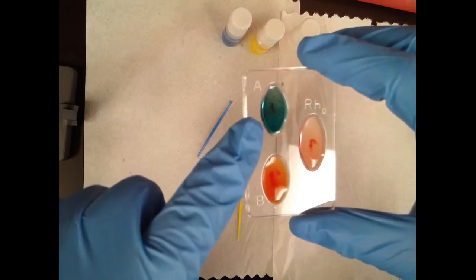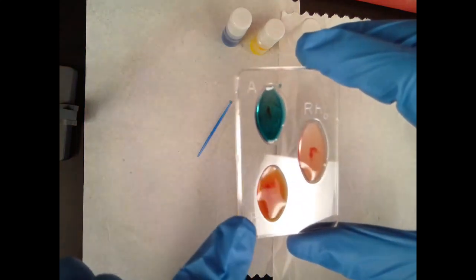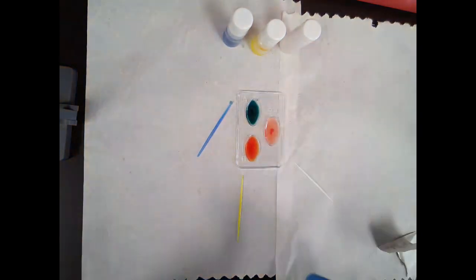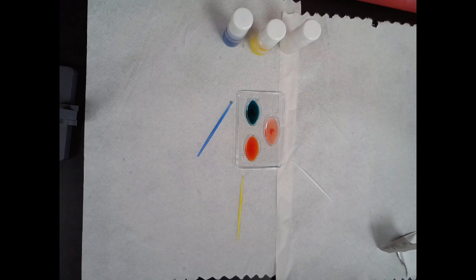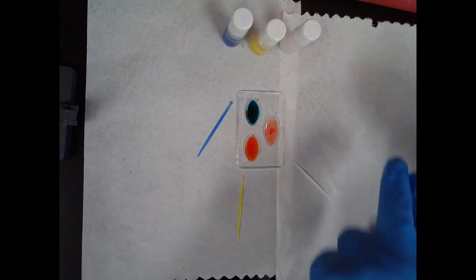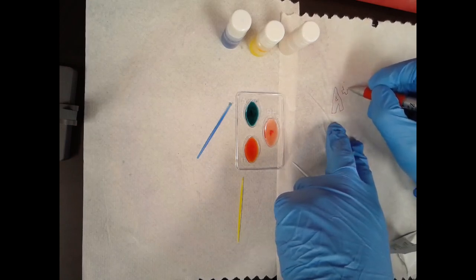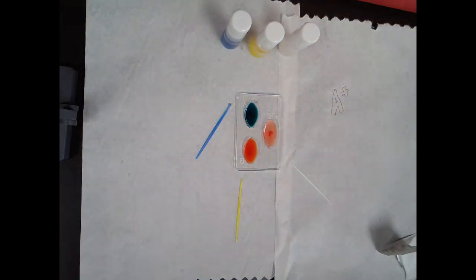We have agglutination with A, we have no agglutination with B, and then we have agglutination with the RH factor. I want you to tell me, well, granted, that would be weird if you told me, but I want you to just take a moment to think, what is my blood type? My blood type is A positive.